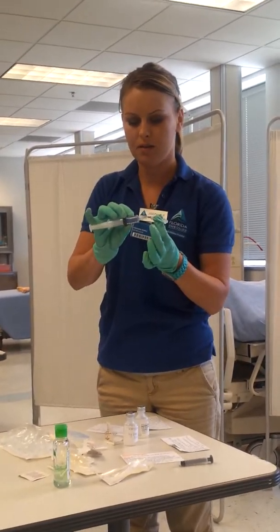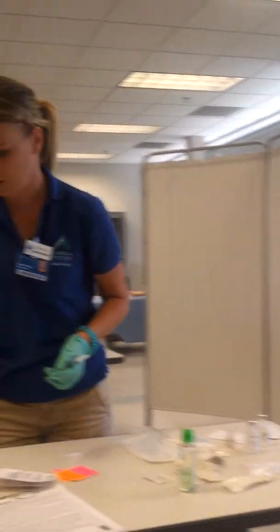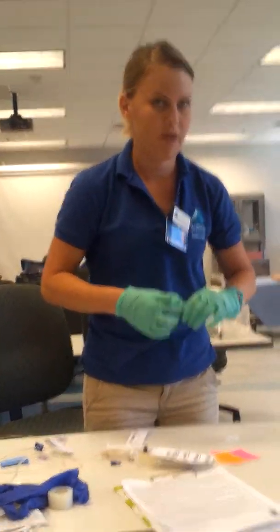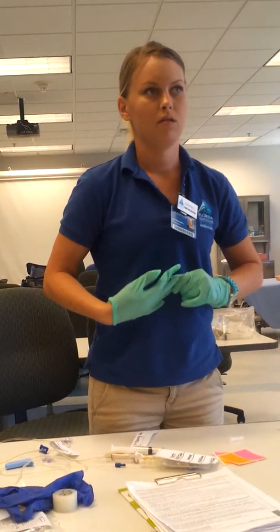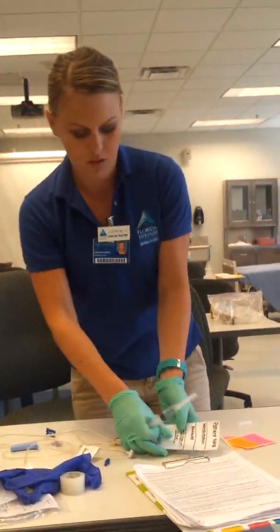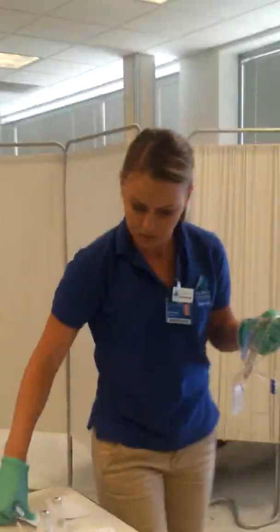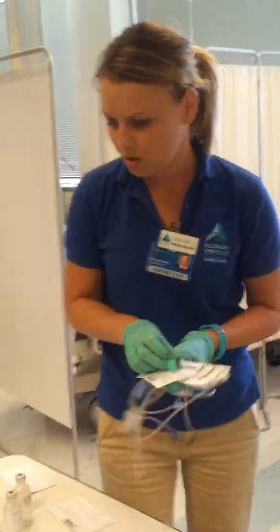I'm going to recap my needleless system. So now I'm ready to go into my patient's room. I'm going to remove my gloves and perform hand hygiene. I've got my medication, my saline, and my MAR. Now I'm going to go into my patient's room.